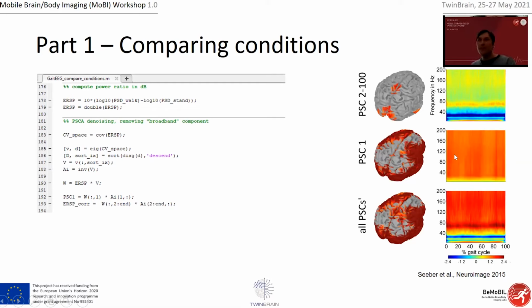Even more strikingly, if you then look at the topography or source images, those artifacts should be gone. By definition, these activities plus these activities result in the raw data, but what I did is the opposite. I just take the raw uncorrected data and split it up into things I think are physiological and things I think are artifact. And that works pretty well in a lot of people.